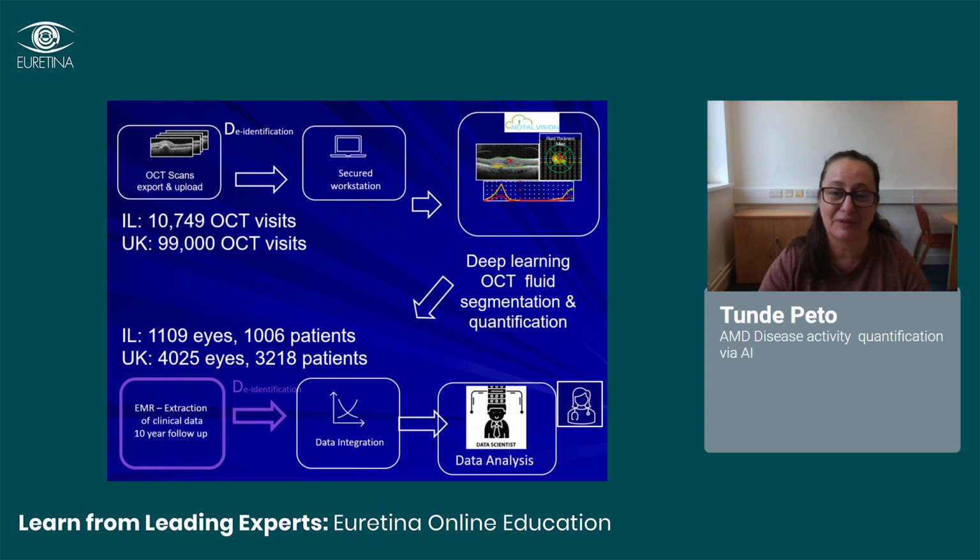But we have really needed to think about how we will be securing the data set, and how we will be grading the data set for fluid. And this is where, again, Notal Vision came in.